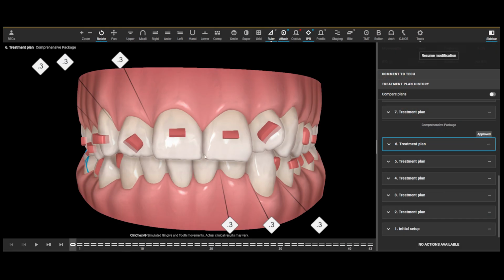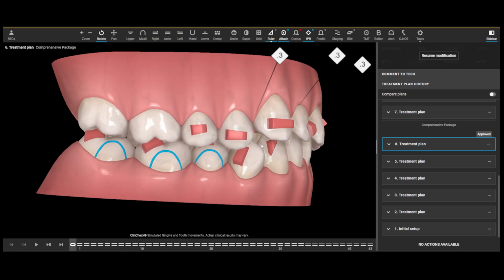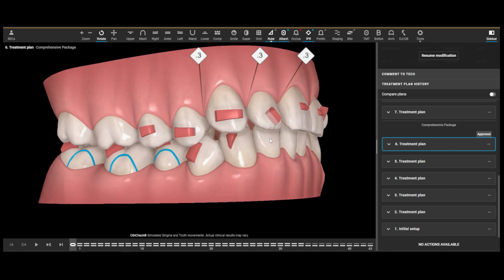So let's look at the plan, and then I'm going to show you how we place the TADs. I'll also show you then how things actually look. And you can see I didn't necessarily do everything exactly the same as what was shown here. Some of the things change over time, but so here's plan 6.